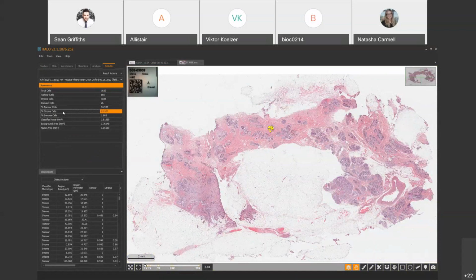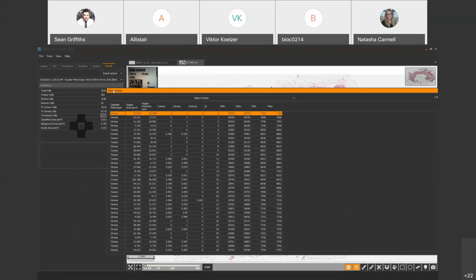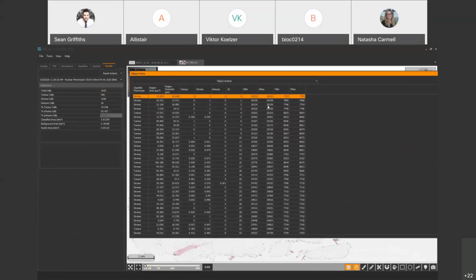But when you run the regular nuclear segmentation using the watershed method in the analysis modules, and you run this at a single cell level, you get the actual coordinates of each cell, which you can then feed into downstream processing, which is a really interesting option. So is there any way to get the actual cell level data and coordinates for each cell?